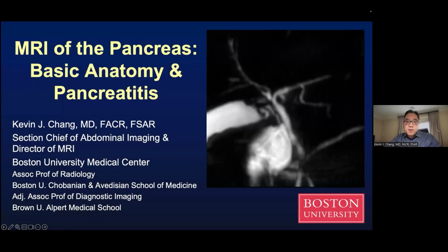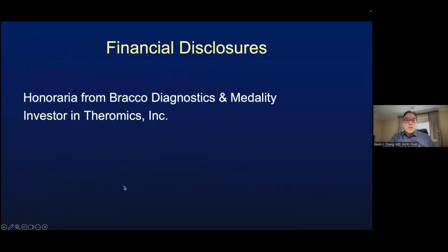Thank you very much for the kind invitation to give you guys a talk about MRI of the pancreas. Usually this talk takes a couple hours. I've decided to divide it up, and the first half of the lecture that I usually give is regarding basic anatomy as well as pancreatitis. So basically non-lesions and non-malignant findings in the pancreas. These are my disclosures.